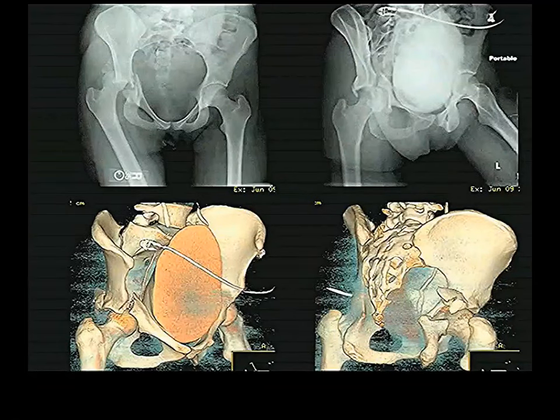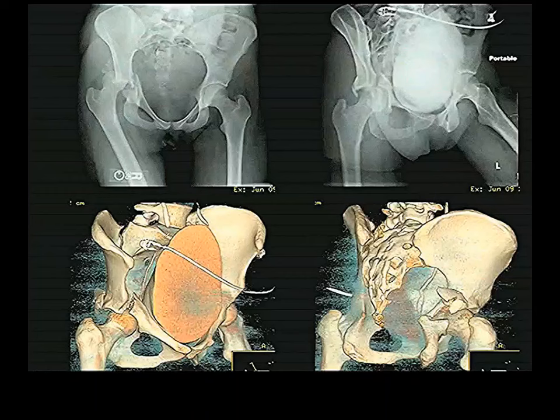Here is a bad thing that happened to a person — an X-ray taken right after an automobile accident. I wouldn't be surprised if she was sitting in the front seat without a safety belt, was thrown forward, her knee hit the dashboard, and drove the head of her femur out the back of the acetabulum.